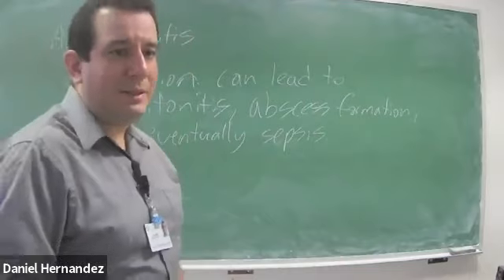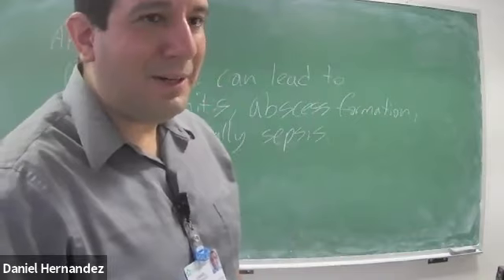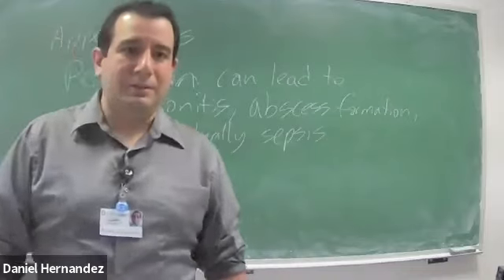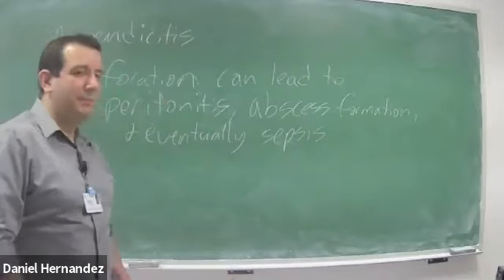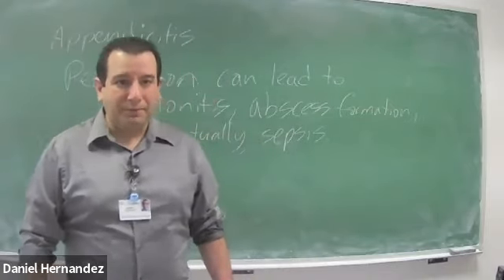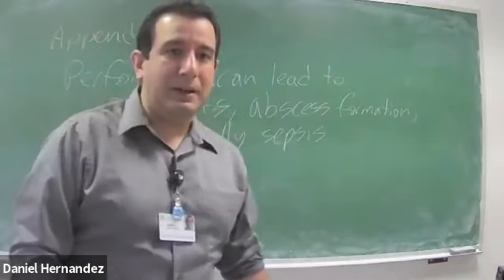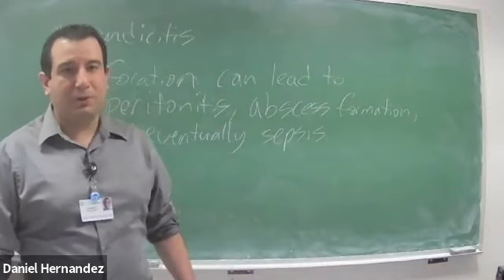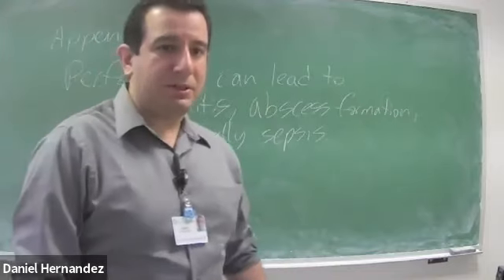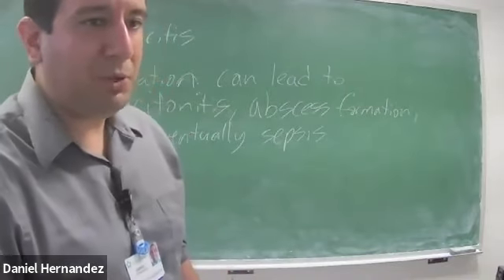I know our PowerPoint says to start with a curved array. I disagree. I say start with your highest frequency transducer and work your way backwards, because you're saving yourself time. The radiologist is going to want those high frequency images, because without a high frequency transducer, it's hard to really visualize the mucosal layer of the appendix to determine if there is sign of rupture. With a curved probe, you're not getting that resolution or detail to examine that mucosal layer for signs of potential rupture.